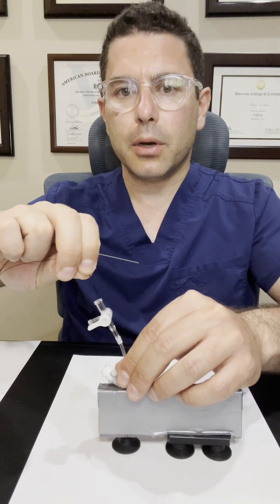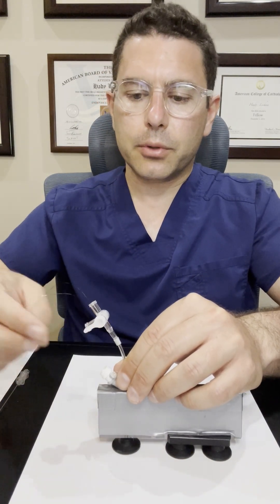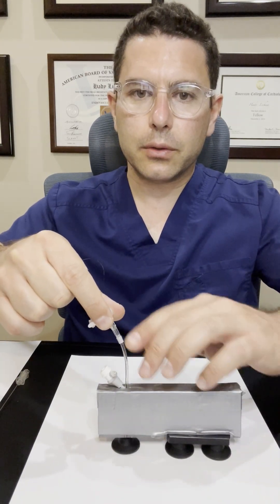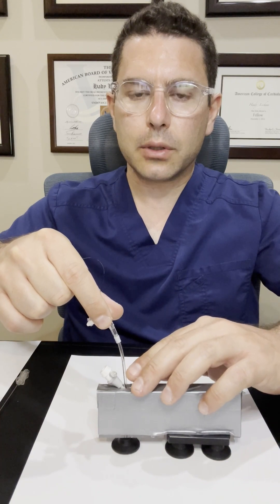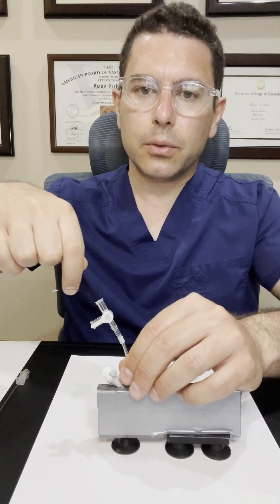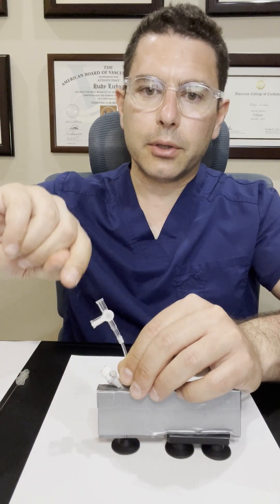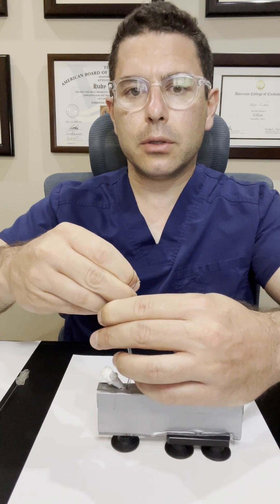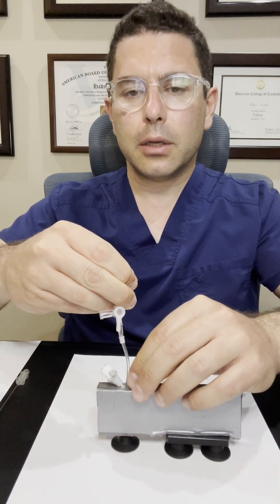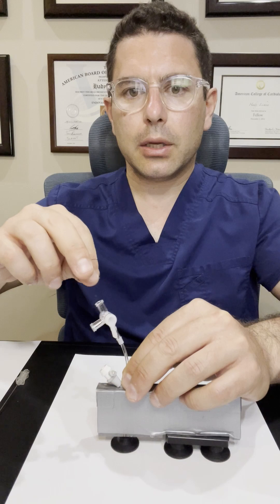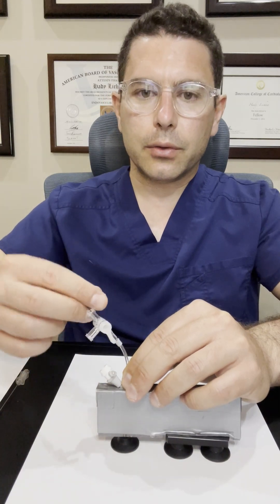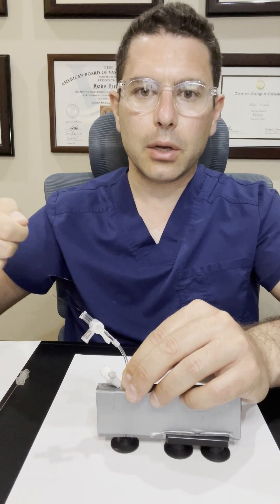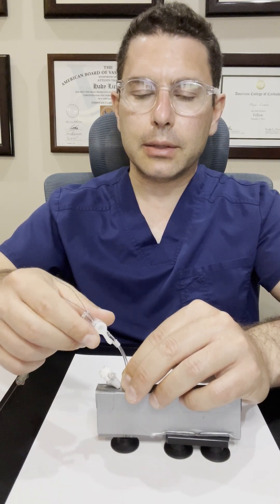But both of them are out of the side port at this point. So the whole purpose of the technique is to have not only those sutures housed in a sterile fashion, but also this will allow you to pull on the non-locking suture up. While there's tension, you're going to be locking the side port in this direction, and this will allow the sutures to be locked in place, and that tension, the back tension on the arteriotomy site, to be maintained.